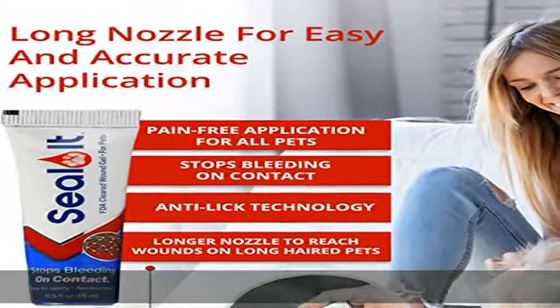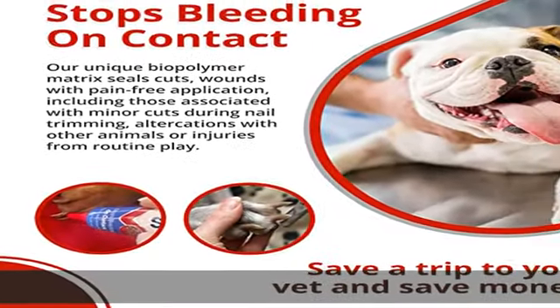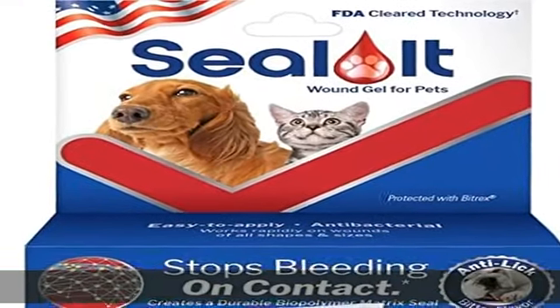This clear hydrogel is laboratory tested and MRSA tested, and includes the powerful safe agent bitrix that reduces your pet's interest in licking their wounds. Its fast-acting and pain-free application ensures quick and efficient results, providing your pet with immediate comfort.